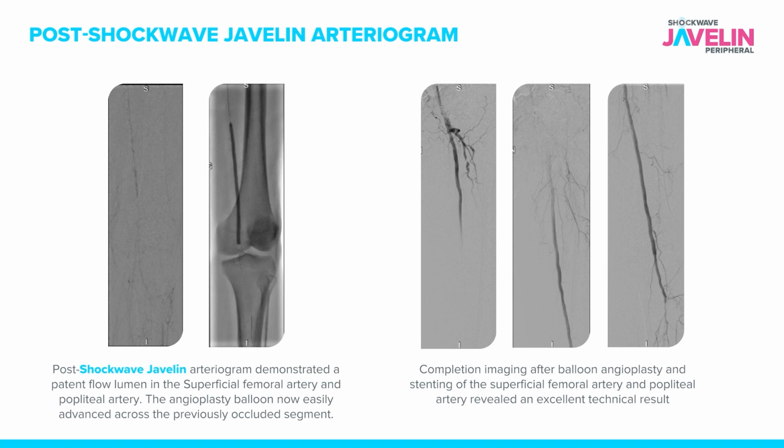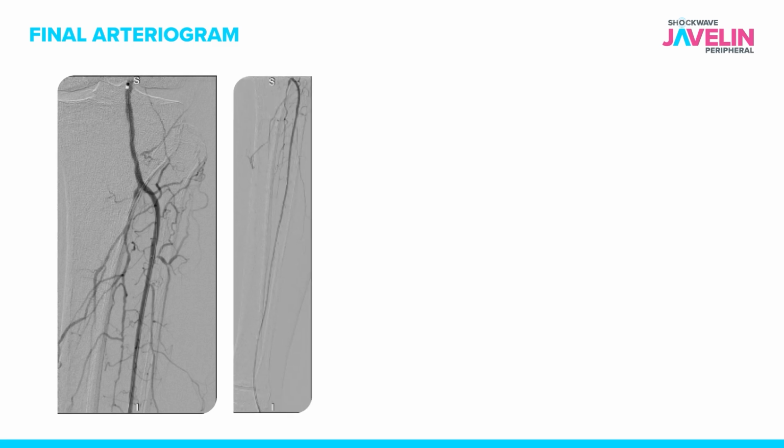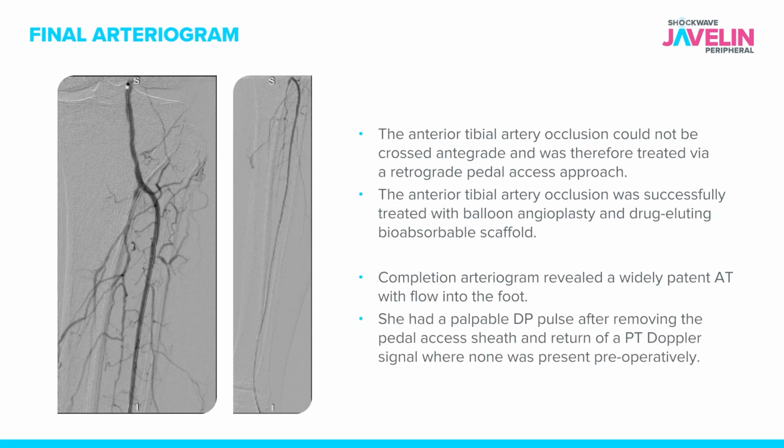And the completion images you can see here demonstrated an excellent technical result with a widely patent SFA pop segment and no significant residual stenosis identified. We were unable to cross the anterior tibial artery in an antegrade fashion from an up and over approach, and therefore I performed retrograde pedal access to successfully cross through the proximal anterior tibial artery, which was treated, and the completion arteriogram demonstrated a widely patent anterior tibial artery with flow into the foot and no significant residual stenosis.